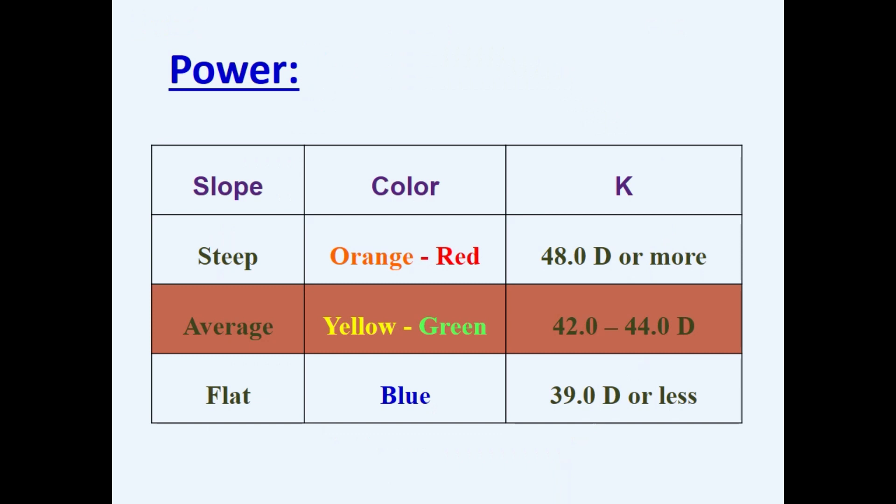The power of normal cornea ranges from 42 to 44 diopters in the center and gradually flattens by 2 to 3 diopters towards the periphery. Normal cornea appears yellow or green. Warm or cool colors are abnormal.